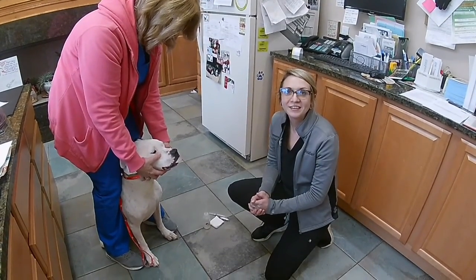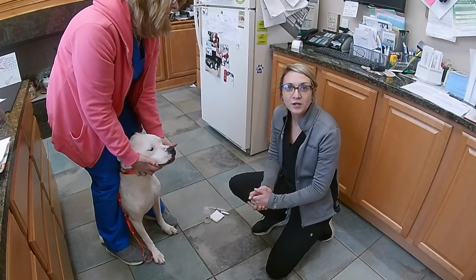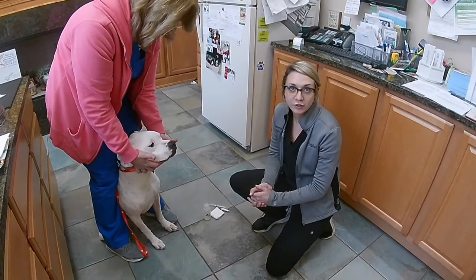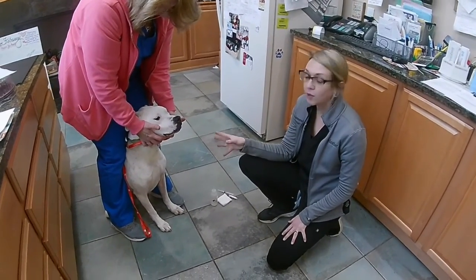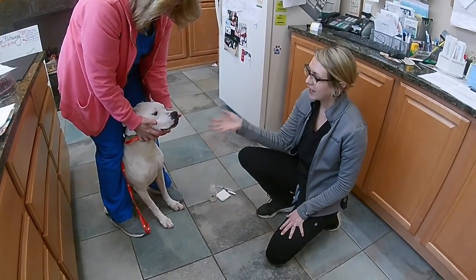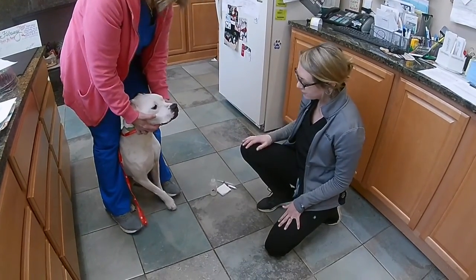Alright, my name is Heather Lieberman. My student ID number is 3309. In this video, I'm going to demonstrate doing a jugular blood draw. So we want our patient in a sitting upright position, and I have my restrainer holding his head up slightly, but still straight.